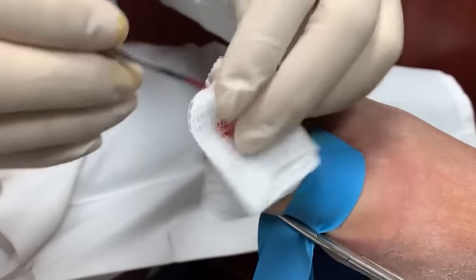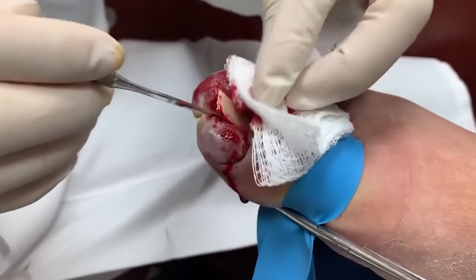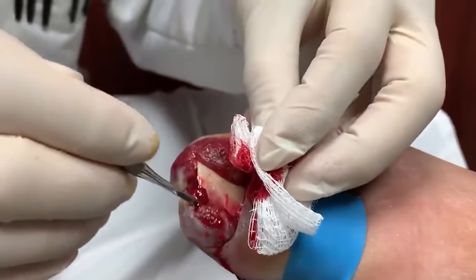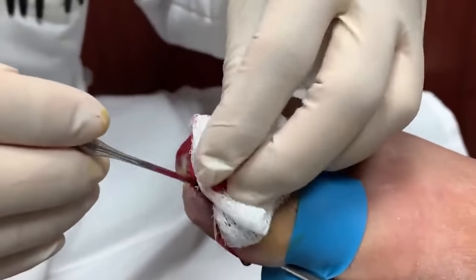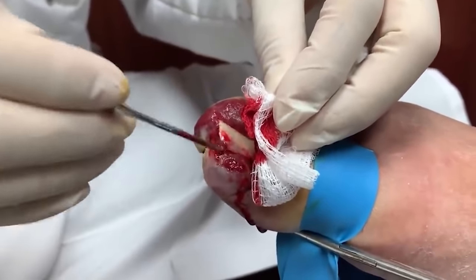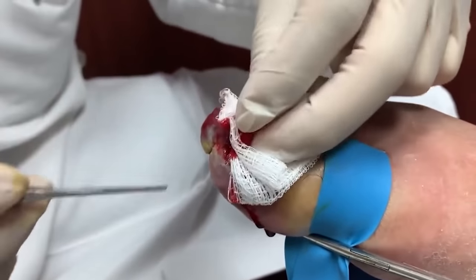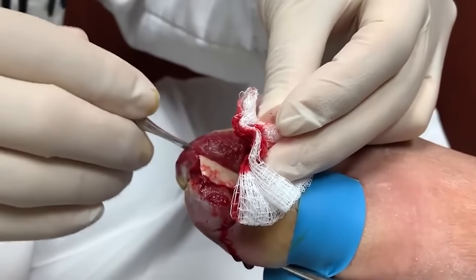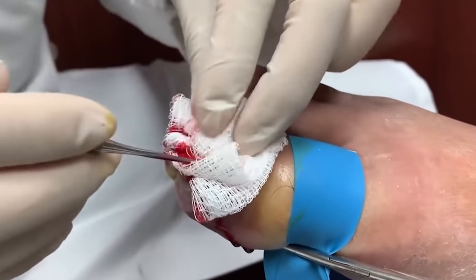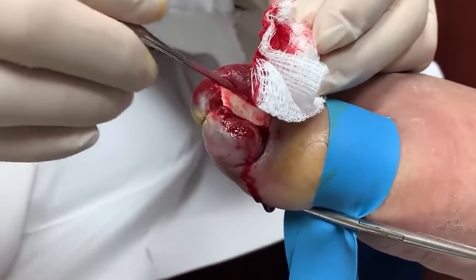Then we let it calm down. We may have to do an extra procedure later to cut out all of this if it doesn't calm down. But in the meantime, my job is to remove the offending nail, try not to do too much damage, and if needed, do an extra procedure later. It's a little bloody — I can't see too well because it's bleeding a lot. This granuloma is very bloody, so I'm just freeing up the nail a little bit.